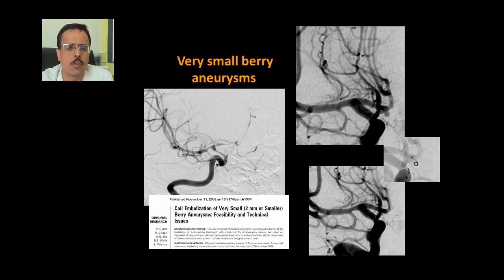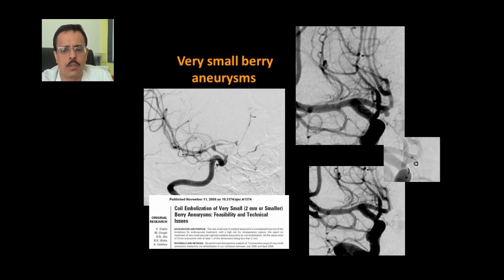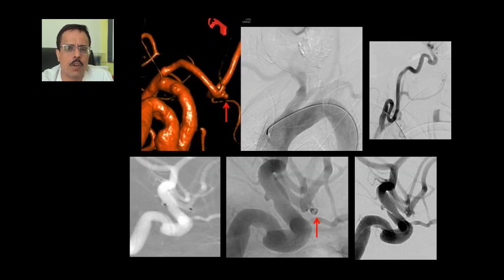One must distinguish these from very small saccular aneurysms, which can be coiled — though the small size makes them technically challenging. This patient with a very small 1.2 mm aneurysm had severe subarachnoid hemorrhage, severe spasm, and a very small probable aneurysm. We performed intra-arterial dilatation, identified a very small anterior communicating artery aneurysm, placed one small coil with complete thrombosis. We were the first group to publish on coiling techniques for less than 2 mm aneurysms in the American Journal of Neuroradiology.